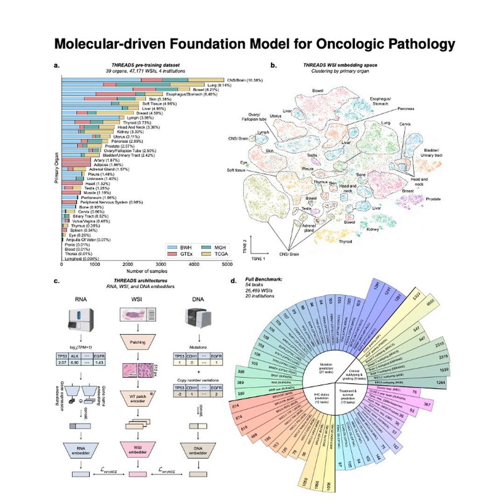And one last point on efficiency, the researchers mentioned Threads is actually physically smaller as an AI model compared to some competitors, right? Yes, that's another interesting finding. Its slide encoder part is up to 7.5 times smaller in terms of parameters than the encoder used by the GIGAPATH model, for instance. So smaller but better. Smaller but better performing, especially on these complex tasks.